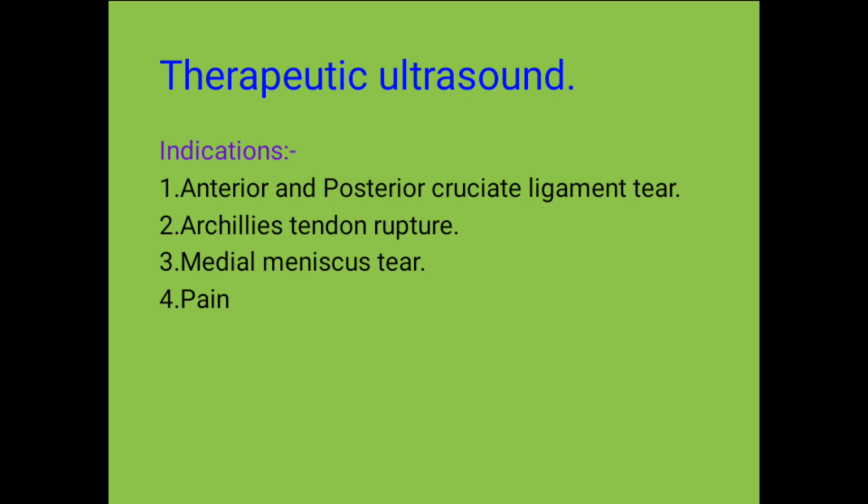Again, therapeutic ultrasound is used in Achilles tendon rupture. The Achilles tendon is just the tendon which connects the gastrocnemius muscle to the calcaneus bone. So you need to get to know this. When it ruptures, therapeutic ultrasound is the most appropriate in management of that condition.